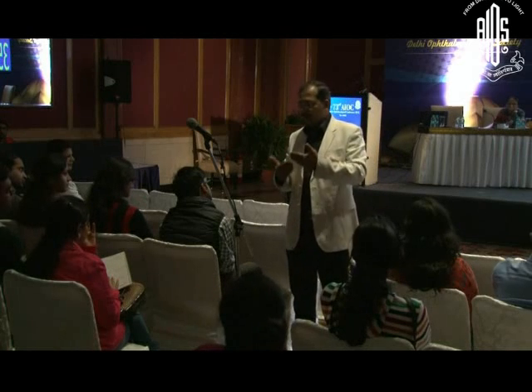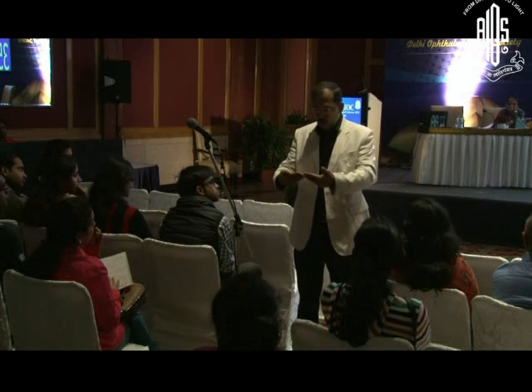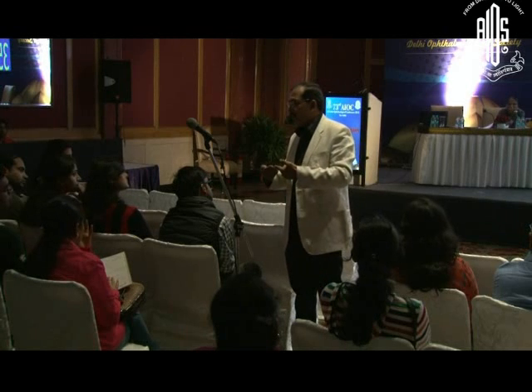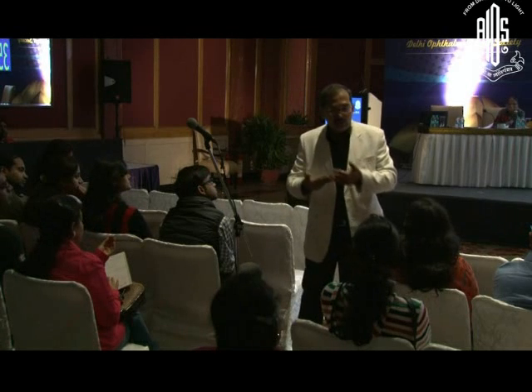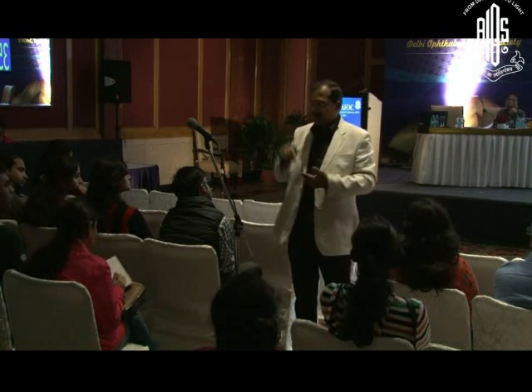So then what you do is check the range of near vision. At this working distance, you have corrected him. Now bring it 3 inches forward. He should be able to see. If he is not able to see 3 inches forward of the working distance, that means you have undercorrected him. You have to add another 0.5.